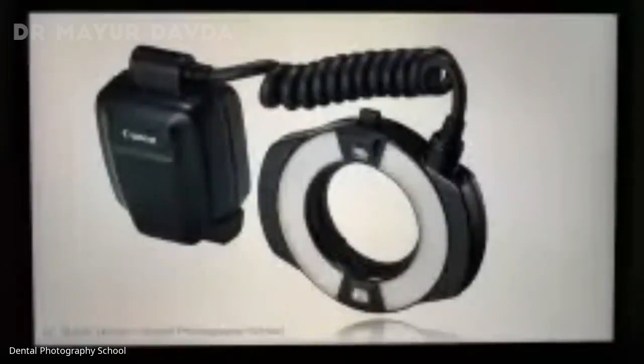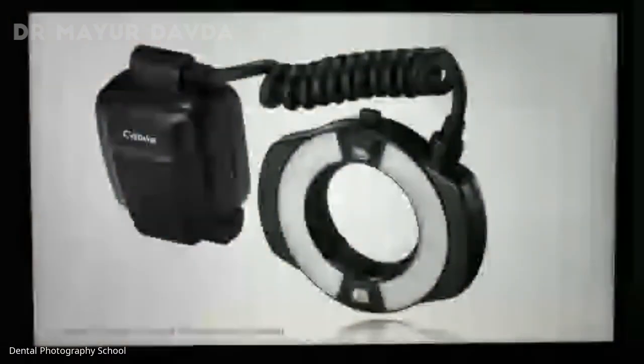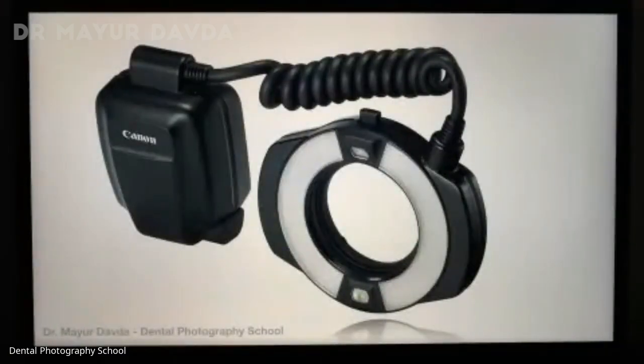for me and for most of the people who are not into aesthetics, like maybe oral surgery, periodontics, orthodontics, pediatric dentistry, ring flash is a better choice because it's easy to use and much more convenient. So the ring flash for Canon is called MR14EX2. Nikon does not make its own ring flash.